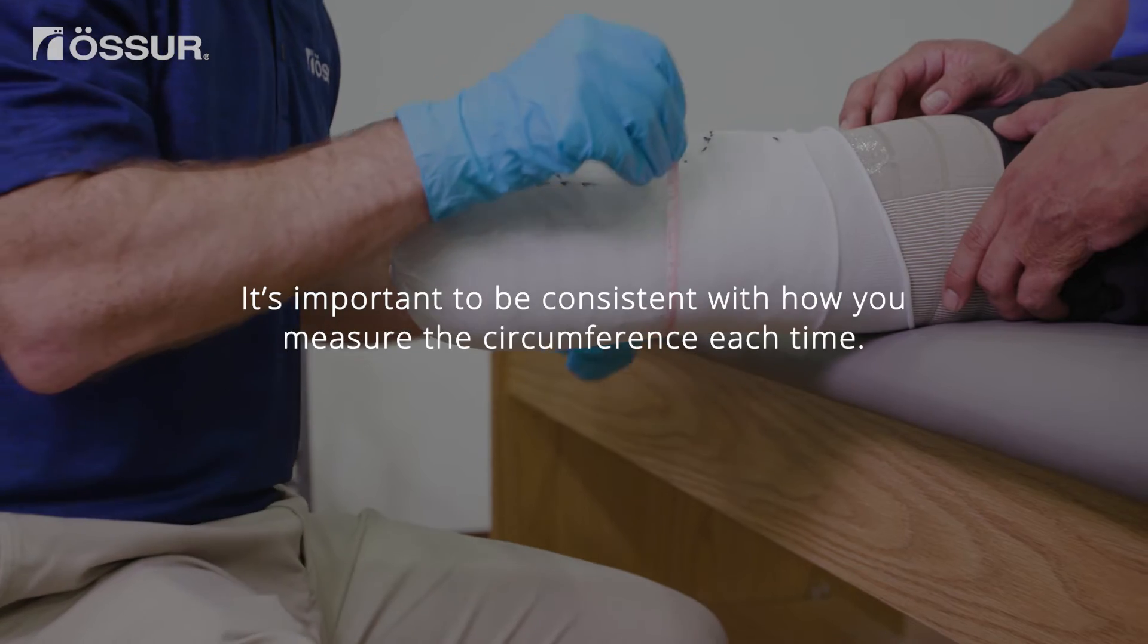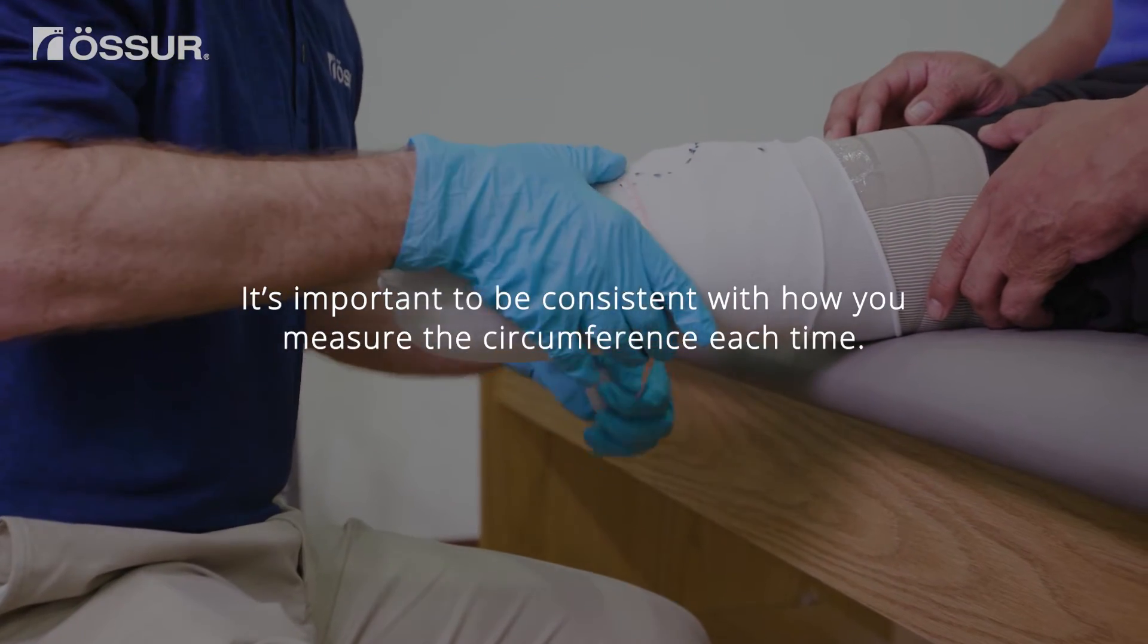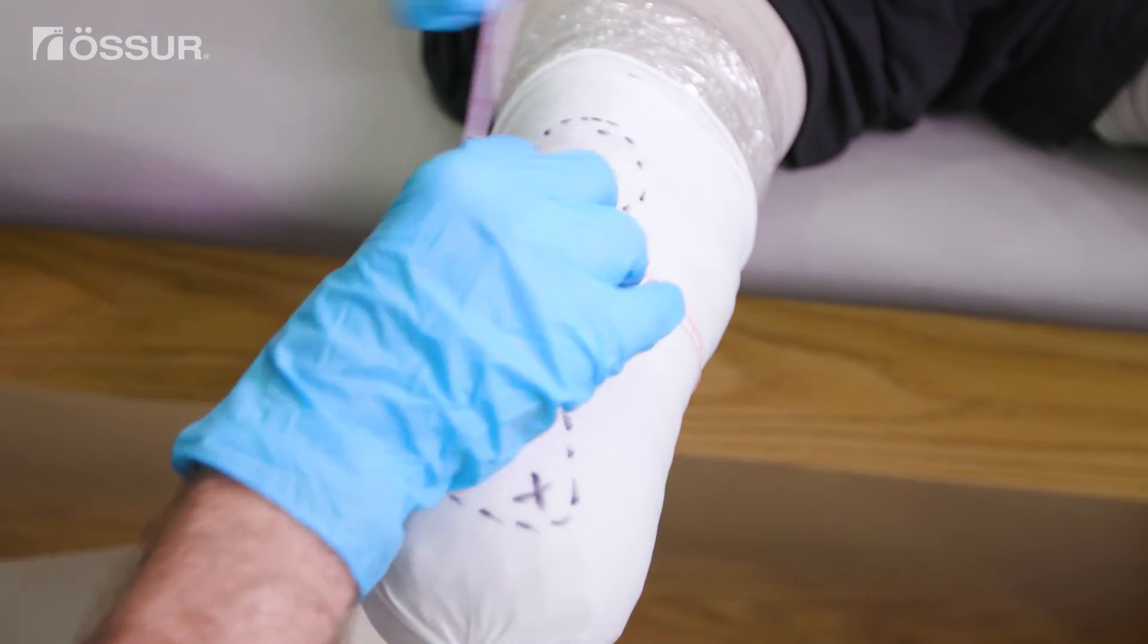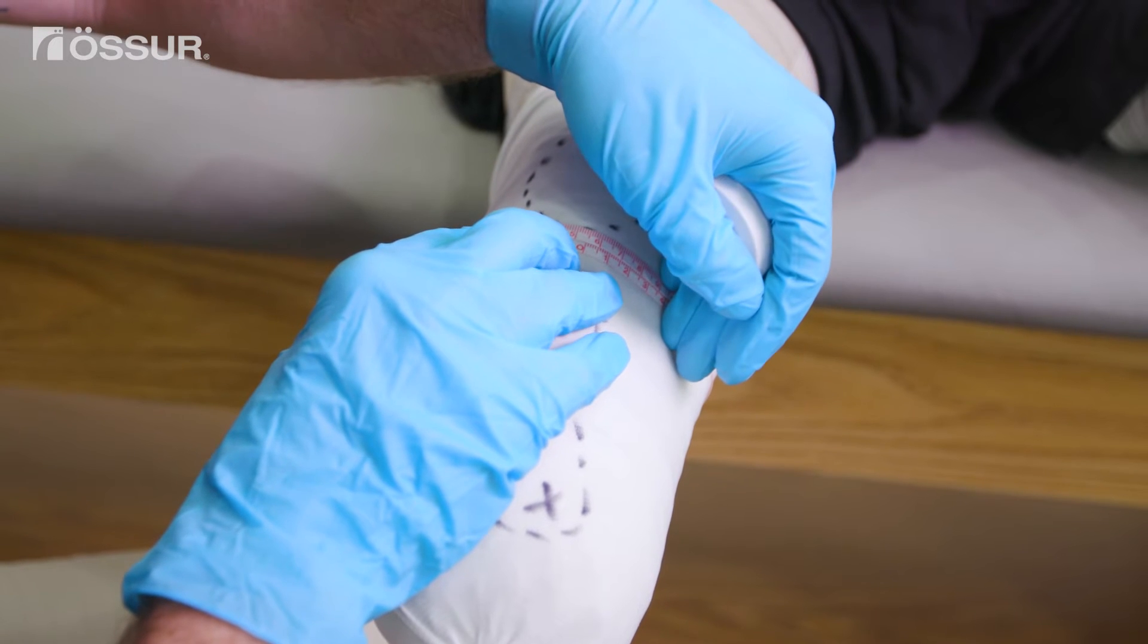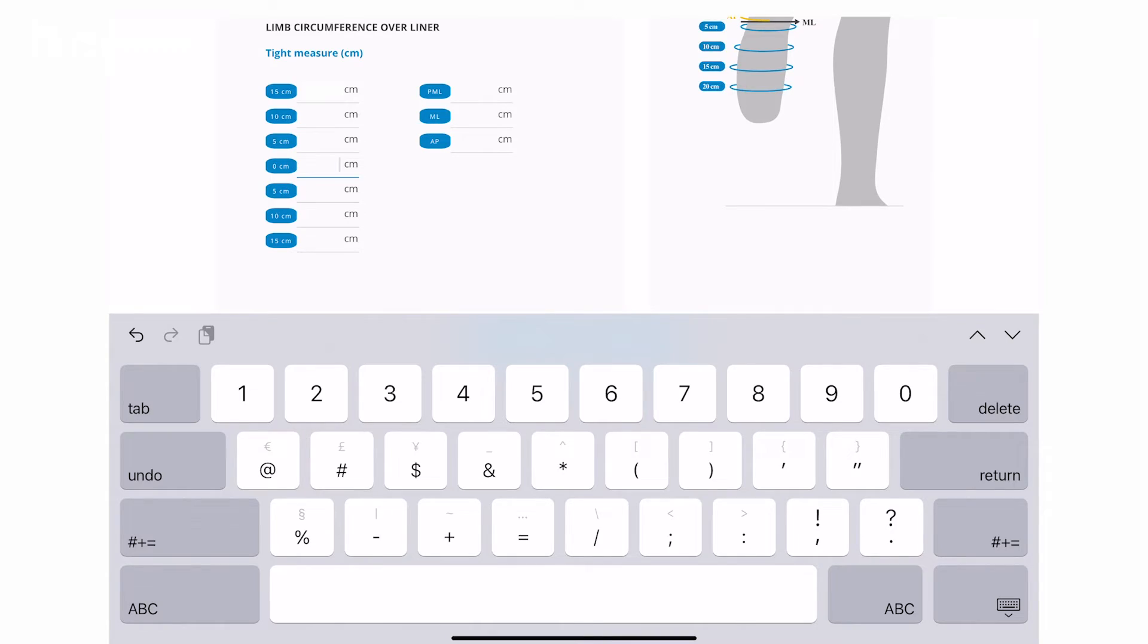It's important that you be consistent in how you measure the circumference each time. Wrap the tape measure around the limb, staying perpendicular to the limb without applying compression. At this marked location, the circumference is 35.4 centimeters.